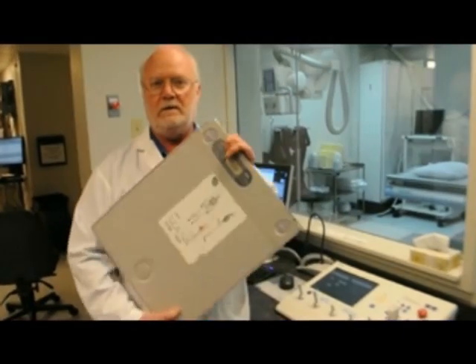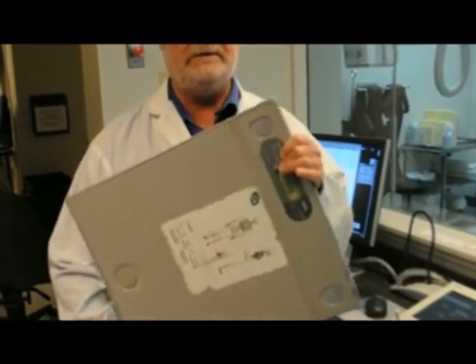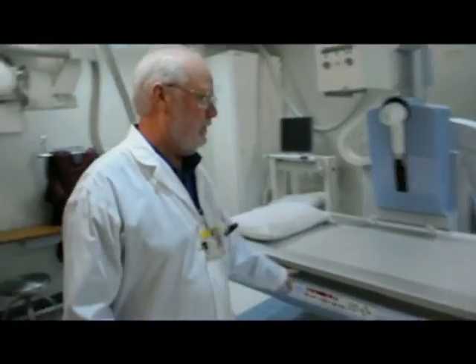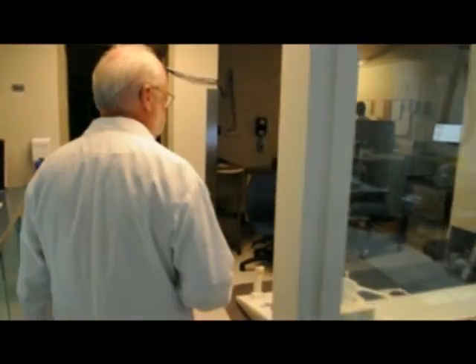Up until a few months ago, when we did X-ray, we were using these imaging plates. These are no longer required, and I'm going to show you why. The new detector is built right into the table, so there's no need to change imaging plates during the procedure on the patient. It's all done from back here. This is all new technology, courtesy of the community — thank you so much.